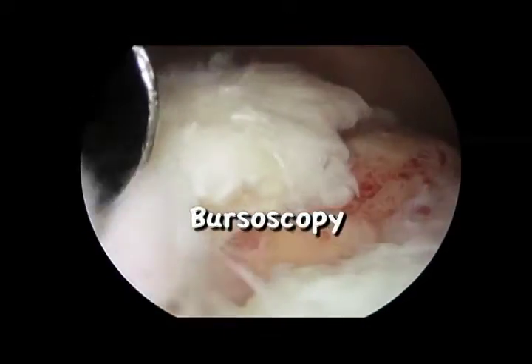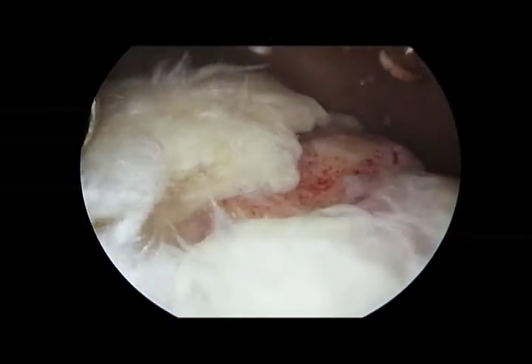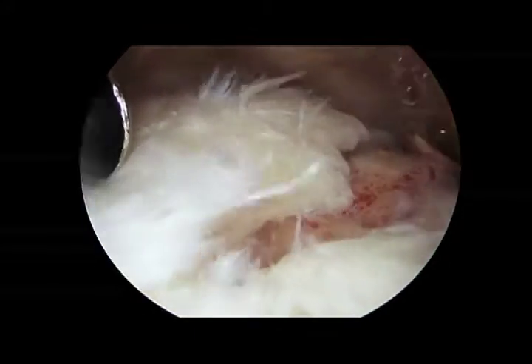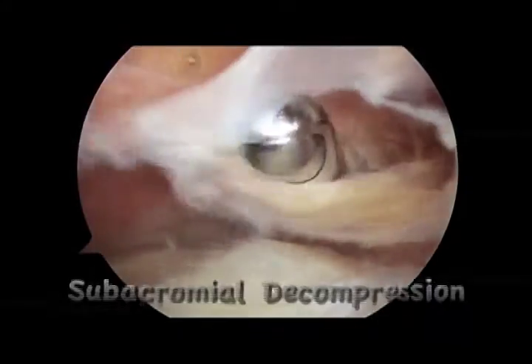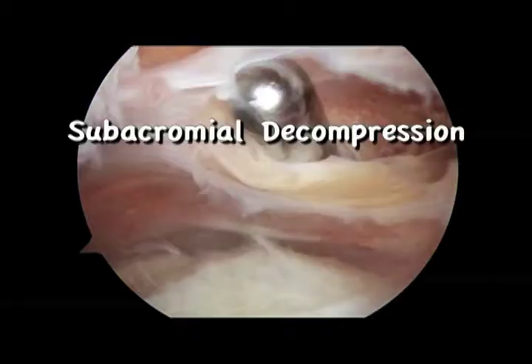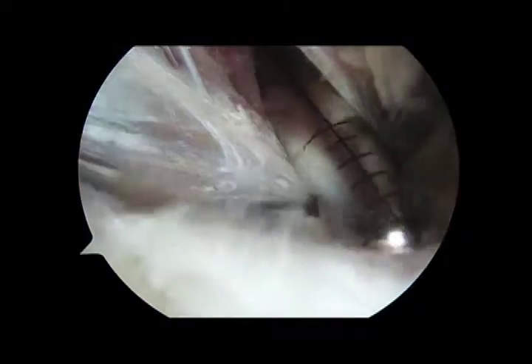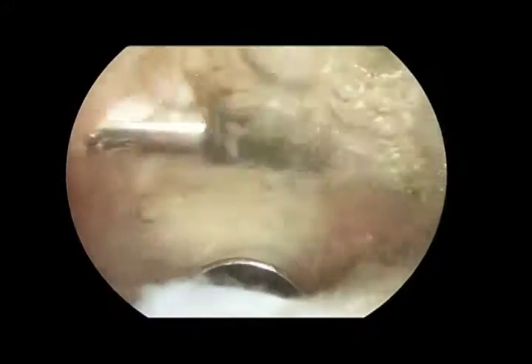Viewing the bursal surface from the subacromial space, we identify the full-thickness supraspinatus tear with a posterior L-shaped component immediately anterior of the intact infraspinatus. A subacromial bursectomy and decompression was then carried out, beginning with debridement of the posterior bursal curtain with a motorized shaver. Using an electrocautery instrument from the lateral portal, soft tissue is debrided from the undersurface of the acromion.